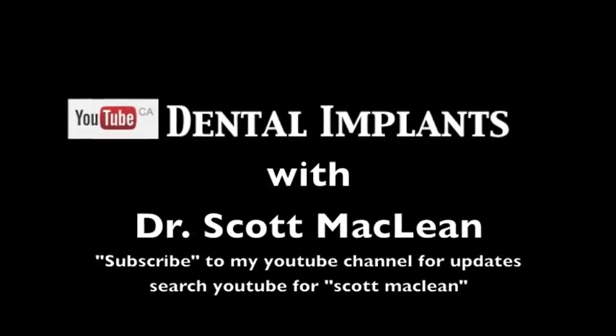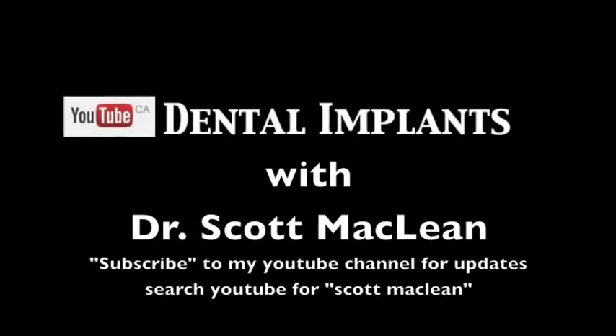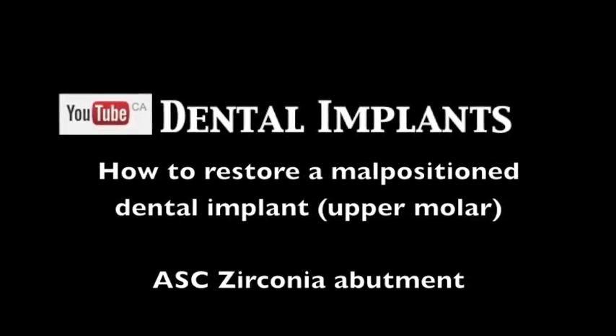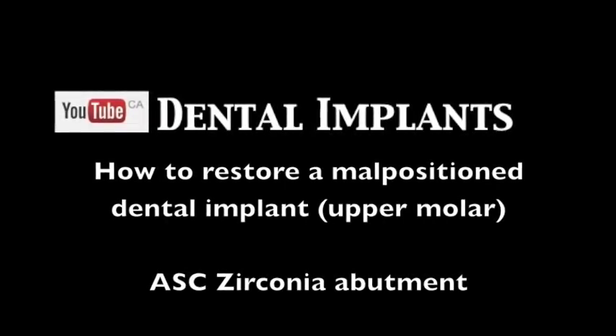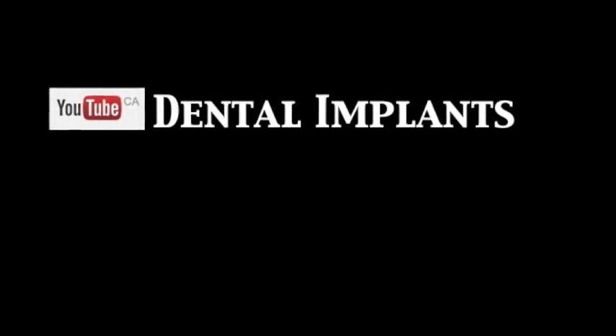This is Dr. Scott McLean and this is a YouTube video about implant dentistry. During this case we'll be showing how to restore a malpositioned dental implant. We're going to be using the ASC zirconia abutment, which means angulated screw channel.